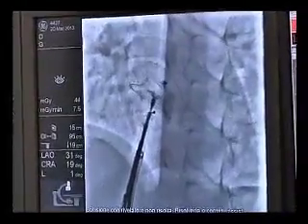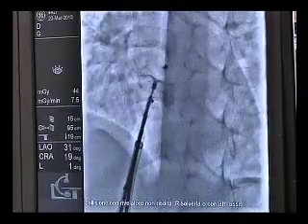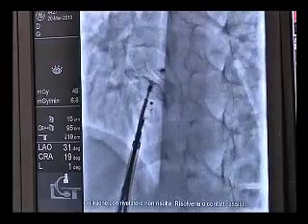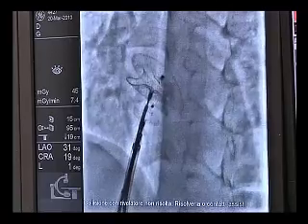They are in very different positions because the septum is very aneurysmatic and floppy. Do you think that this device is somewhat too large for this defect? No, I don't think so.